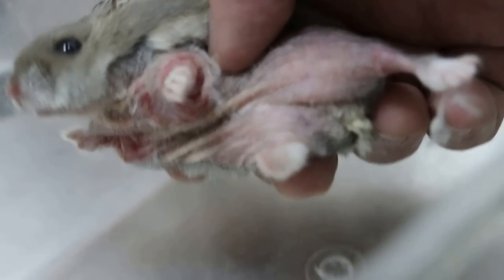It's a very gentle hamster so it's easy to hold him. You can see the hot area — he's biting as well.